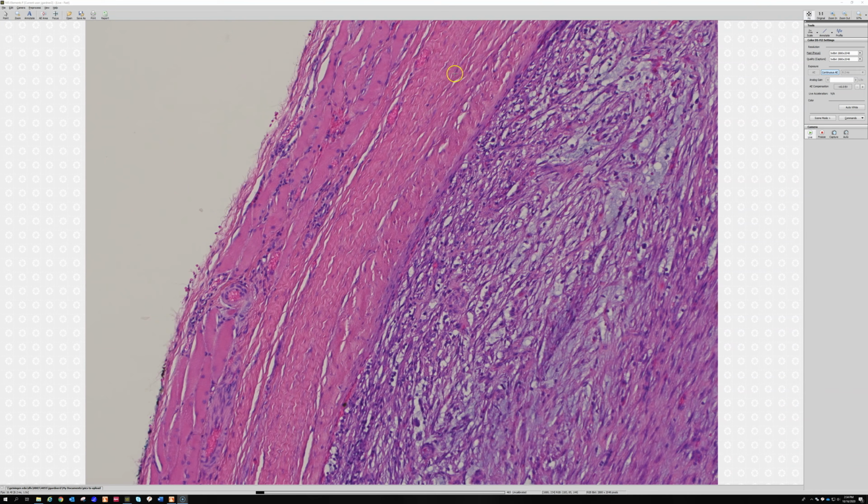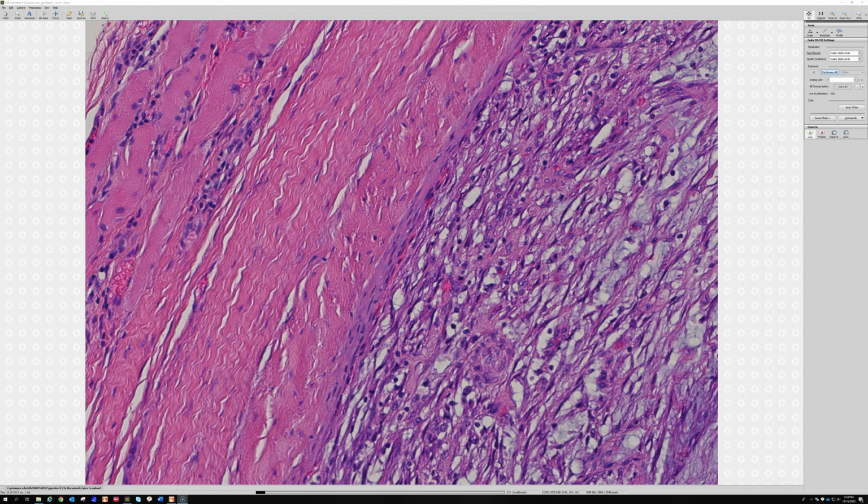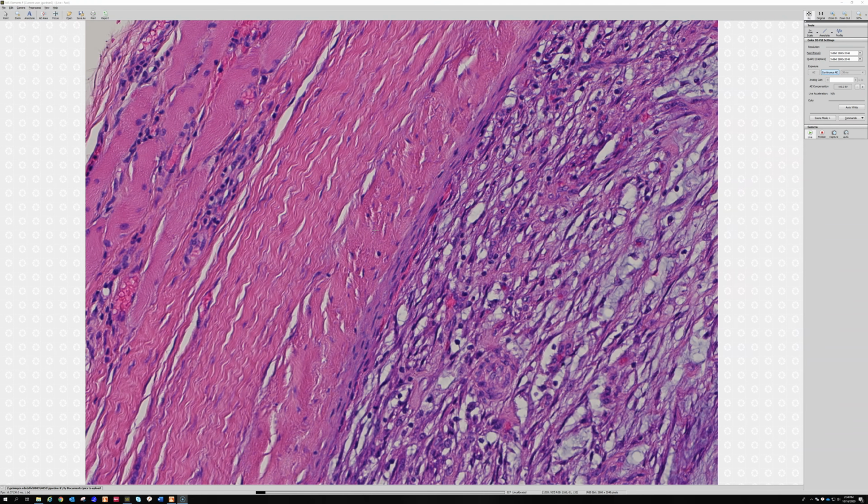And out here, look, this is fascia. See, it's spindle cells with dense pink collagen, and so pink spindle cells in a bundle is either dense regular connective tissue, which is tendon, fascia, or ligament, or it's smooth muscle, or it's nerve. And in this case, we can see that it's super wavy, and the real waviness, that ultra wavy collagen bundles, is not nerve. It's actually what we see in fascia or tendon, usually the dense regular connective tissue. So here's your fascia right here. Here's skeletal muscle right there. And here's the nodular fasciitis coming right off of the fascia.